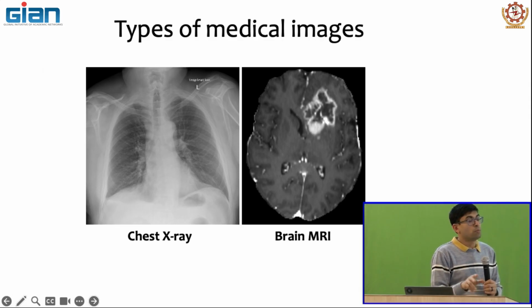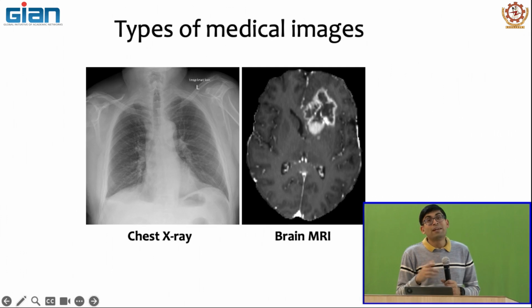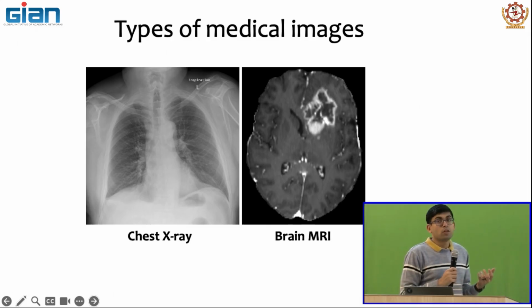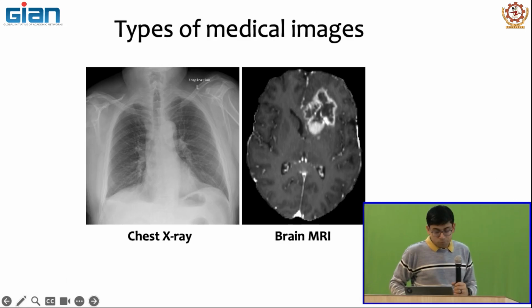We covered a couple of slides on ophthalmic imaging, the ultra wide field fluorescein angiography scans, and for dental imaging we had CBCT scans. These are all different kinds of imaging modalities that you will encounter when working with radiology data. Obviously the most common modality is the X-ray modality, or the radiographs.